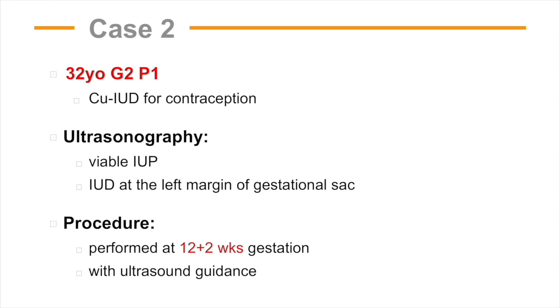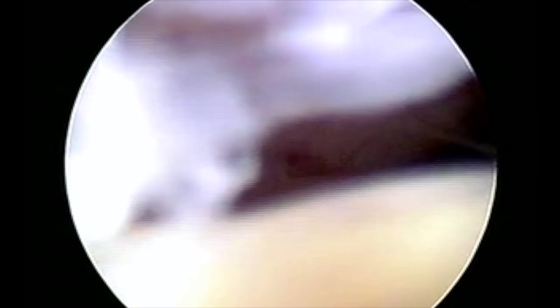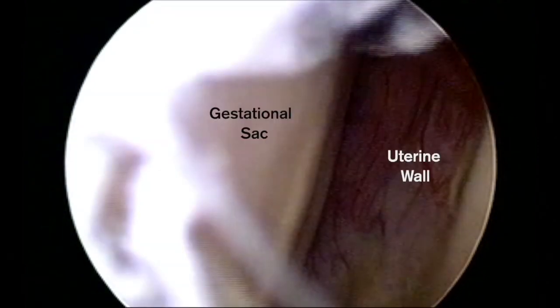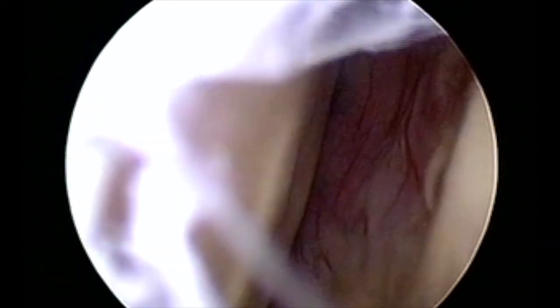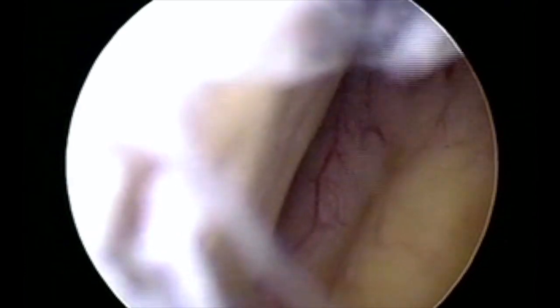Case 2 is a 32-year-old Gravida 2 Para 1 who had a copper IUD removed at 12 weeks and 2 days under ultrasound guidance. This case nicely depicts the challenges in visualization posed by the extensive intrauterine mucus and debris in pregnancy. We attempt to minimize removal and reinsertion of the scope to clean the lens. A track is created to pass the hysteroscope between the gestational sac and the lateral uterine wall. The hysteroscope is advanced slowly with minimal infusion of distension media to avoid disrupting the gestational sac.